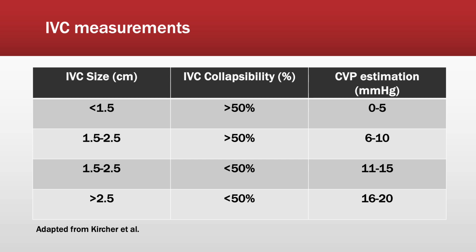So the numbers in the low aspect of CVP, and the high CVPs are a little more accurate, but when it comes to these numbers in the middle, they're obsolete.